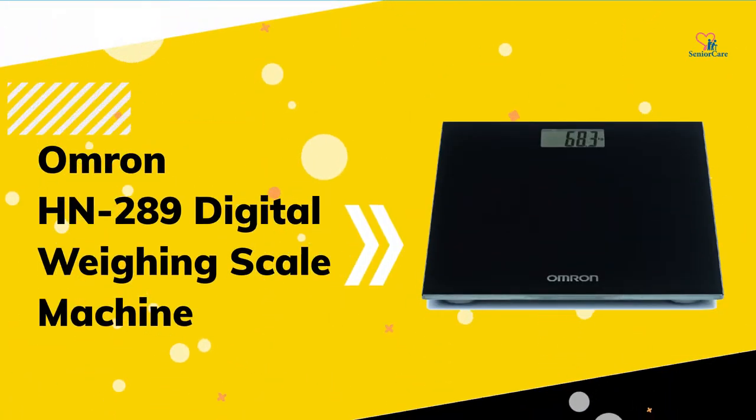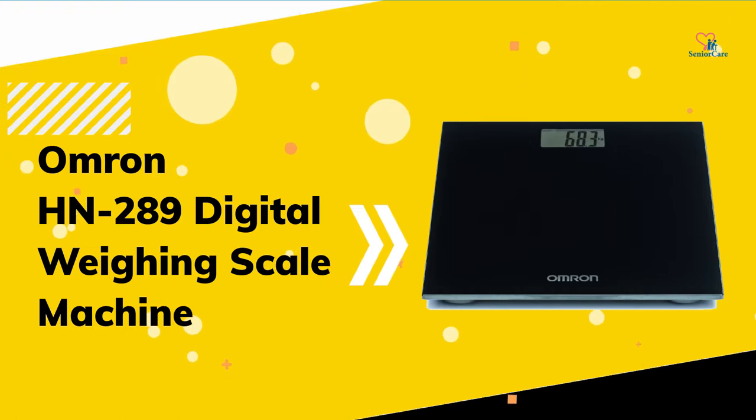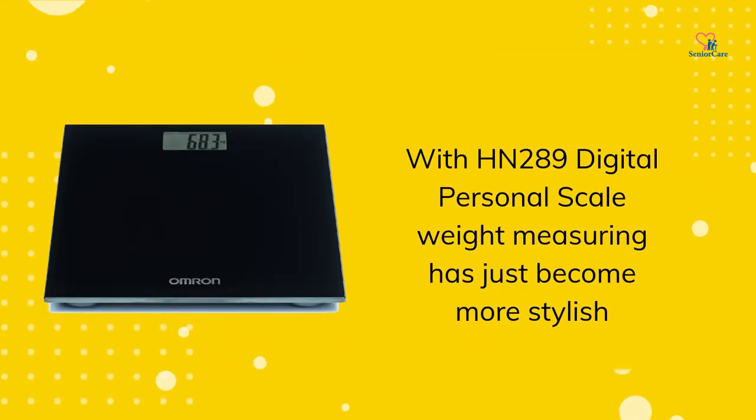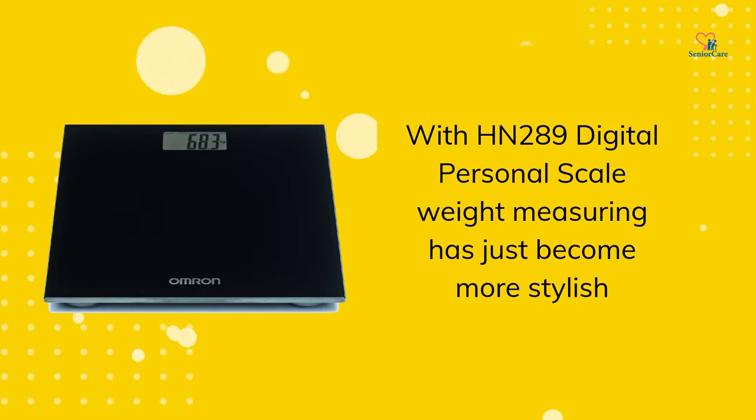Introducing Omron HN289 Digital Weighing Scale Machine. With the HN289 Digital Personal Scale, weight measuring has just become more stylish.